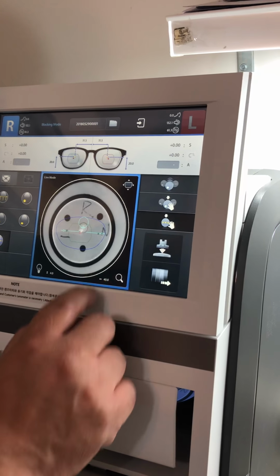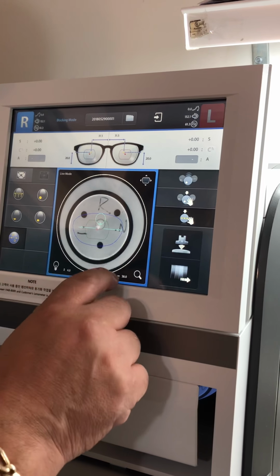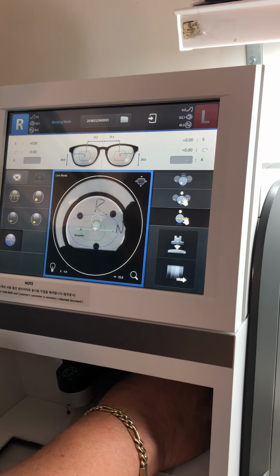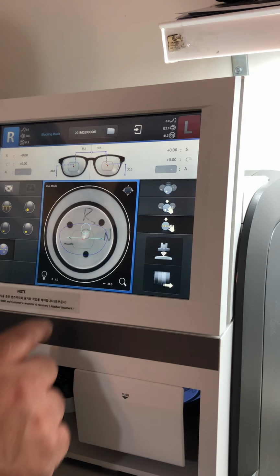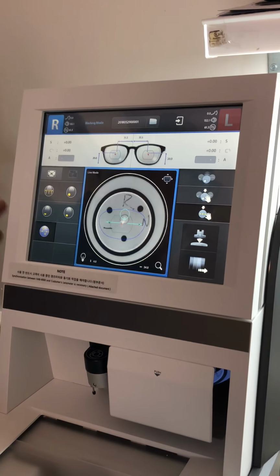So that'll be easy. See where my engraving marks are too wide? I can come right here, and I can change that right here. So yours are 35. Well, yeah, we'll go ahead and I can line them up. It's probably like about 34. And I can bring them in till I'm lined up. Makes it a lot easier.